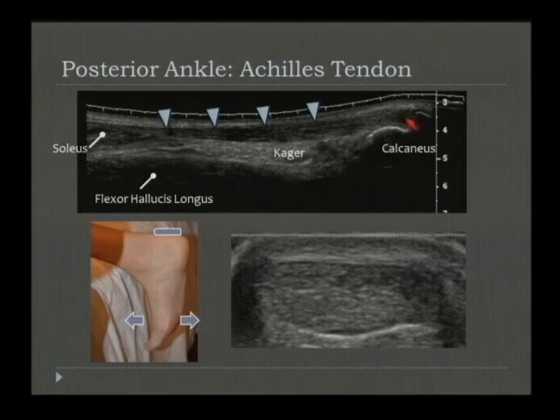In addition, when looking at this closely, especially if you're using high resolution imaging, there is a fibrocartilaginous portion of the Achilles tendon distally at insertion, which helps integrate it into the calcaneus. It typically appears like a small comma, and should not be diagnosed as an intrasubstance tear.